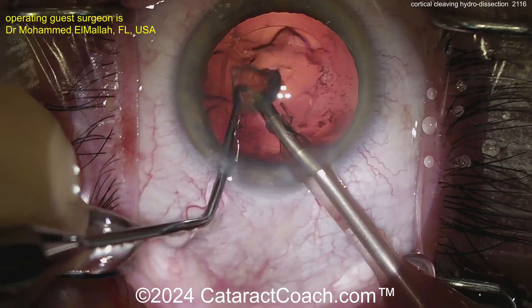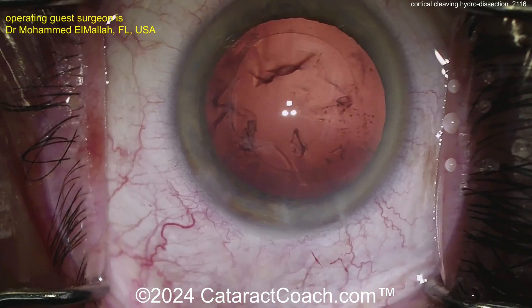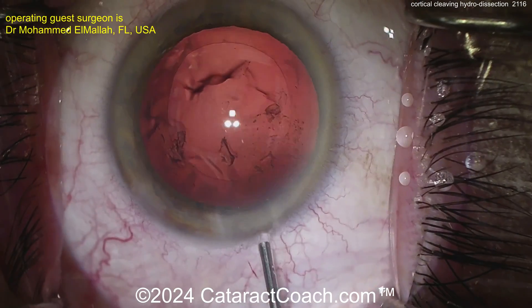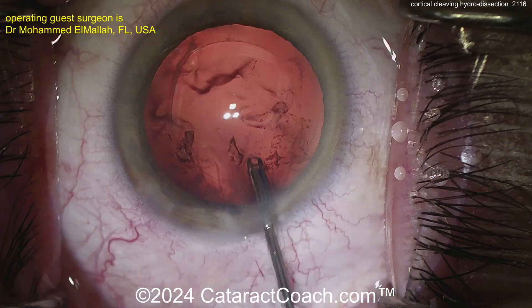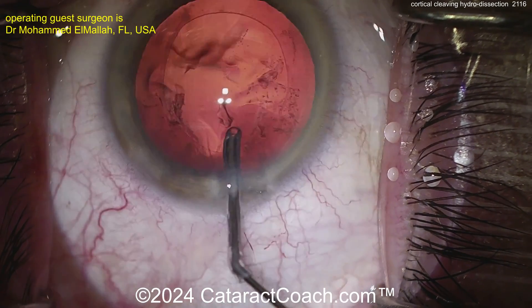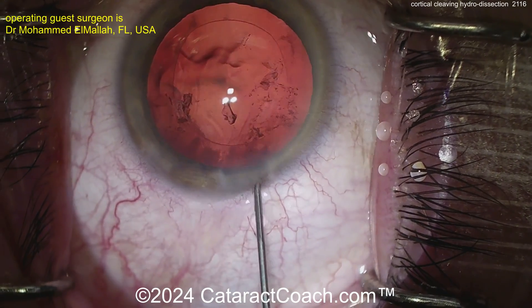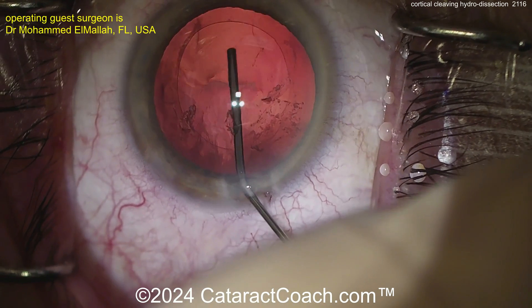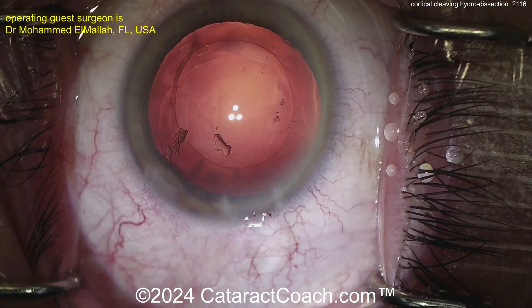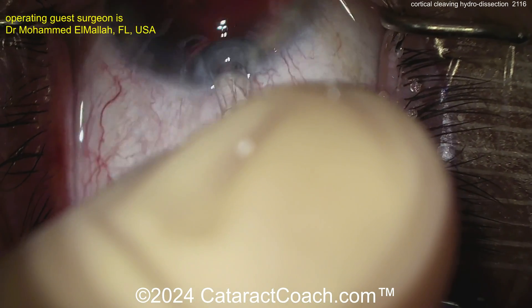Right after phaco, you could actually implant the lens, and whatever little wispy pieces of lens material are left, you can get them out at the time of viscoelastic removal. That's a clean-looking bag with very little lens material. There's a little hydro-polishing, then the viscoelastic goes in to get the bag nice and full. There are tiny wispy lens remnants, but those will come out when you put the IA probe in to remove the viscoelastic. Here comes the lens — a single-piece acrylic IOL going into the capsular bag. Deliver — beautiful.